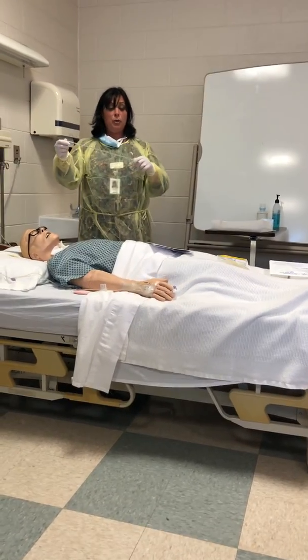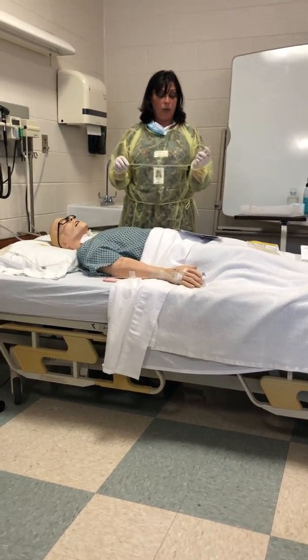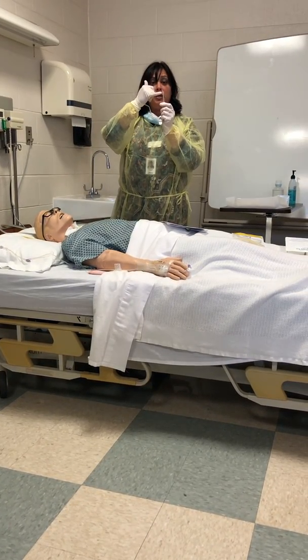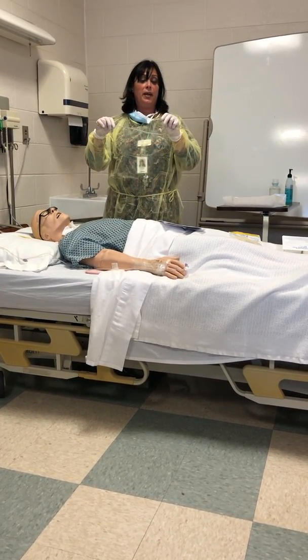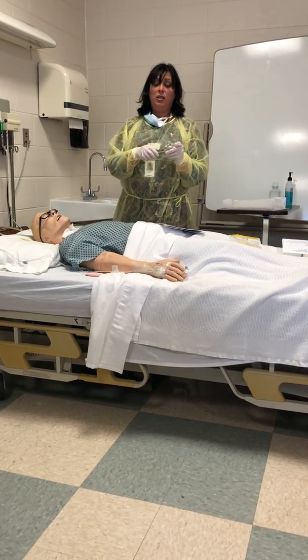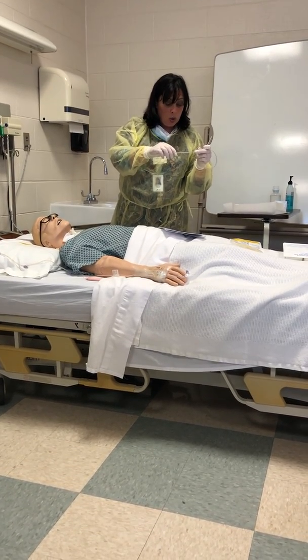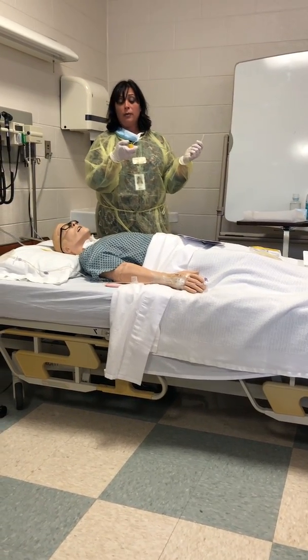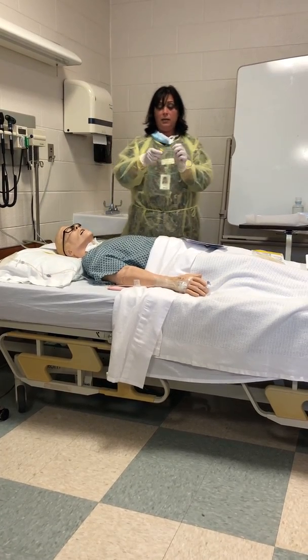Okay, so the catheter is very flexible. Sometimes if they are stiff for whatever reason, you want to make sure that it's pretty flexible. As you can maybe see, the tip's been cut off, so there's a hole at the top and holes on each side. So whenever you put this in there, you want to rotate while you're pulling out. You put it on continuous suction, and in here I think it says to do intermittent suctioning. Okay, dirty hand.